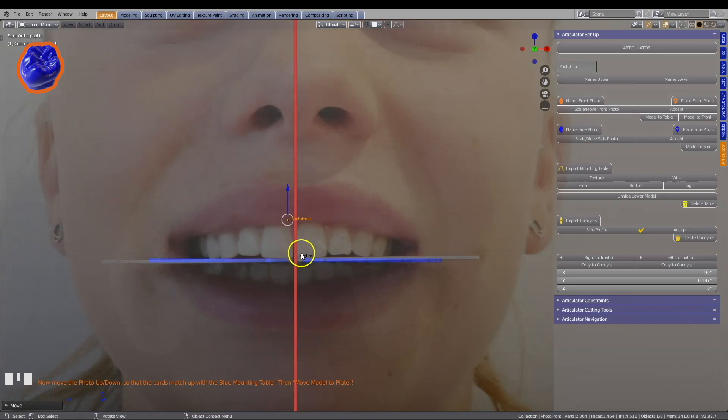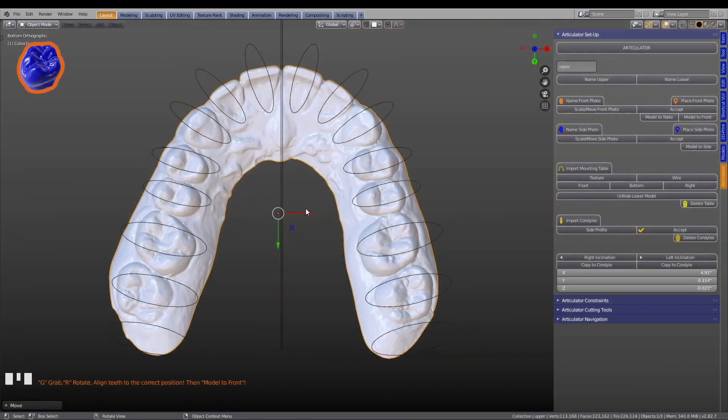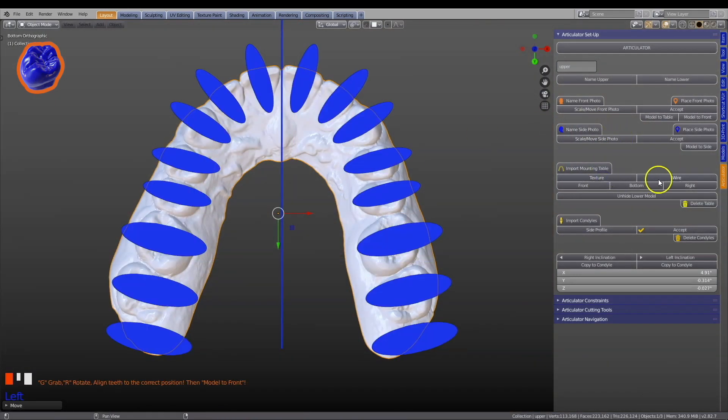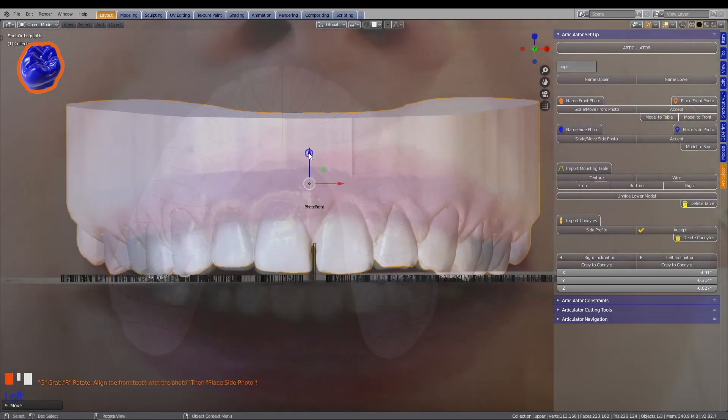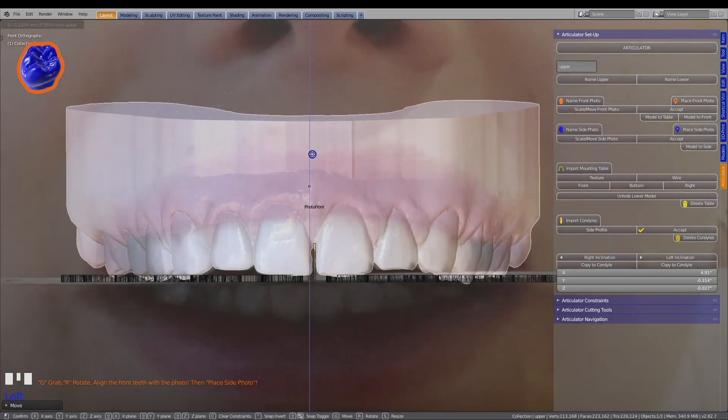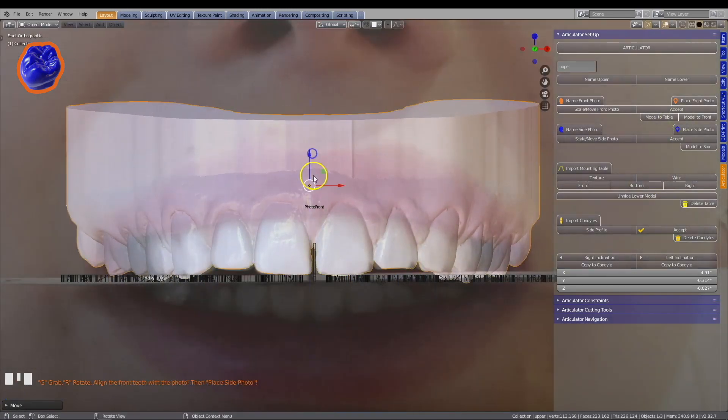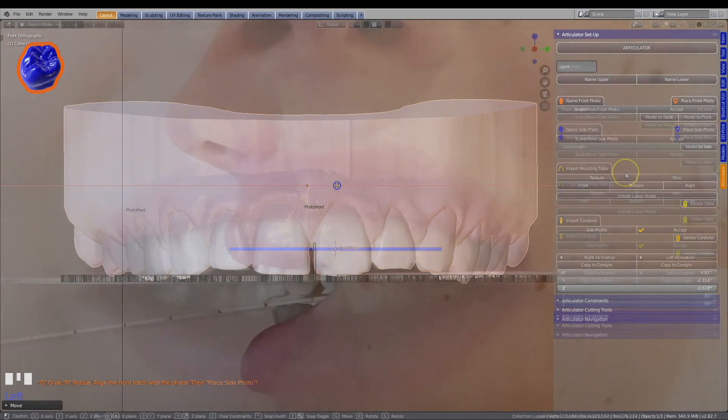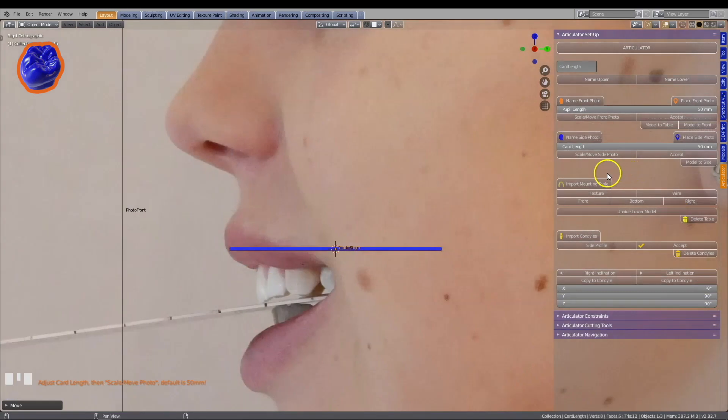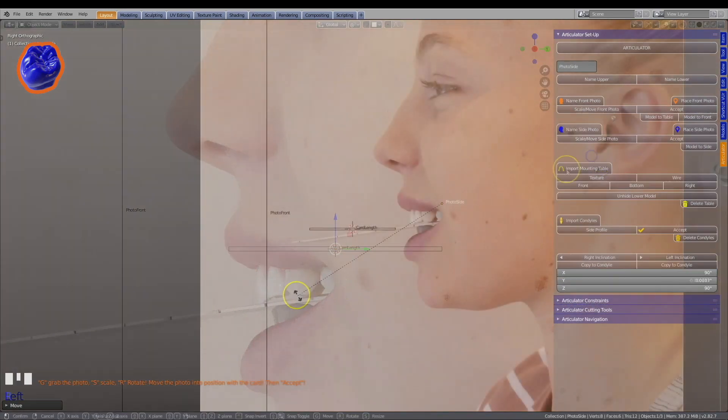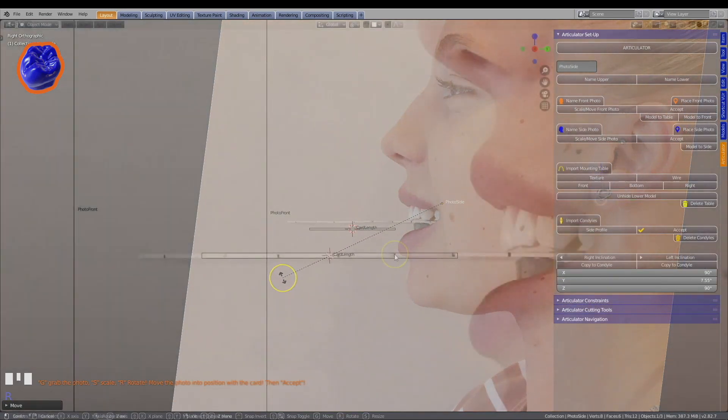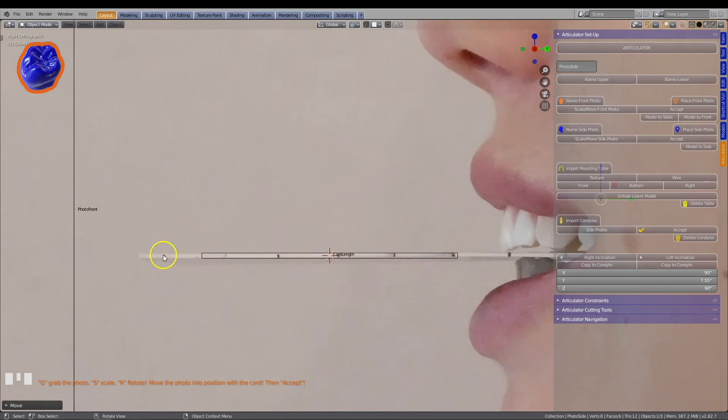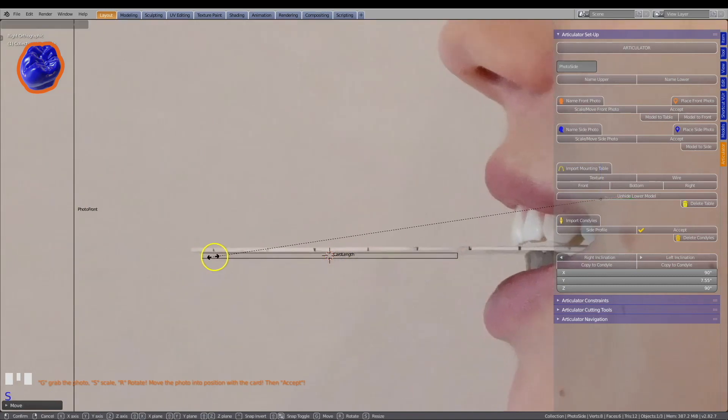By using photos, you can align your patient's teeth into the 3D environment. By using a special card, you can scale the photo into Blender's units of measurement.